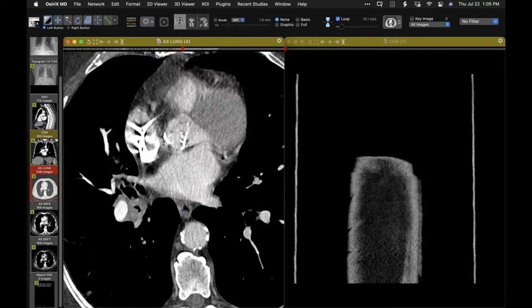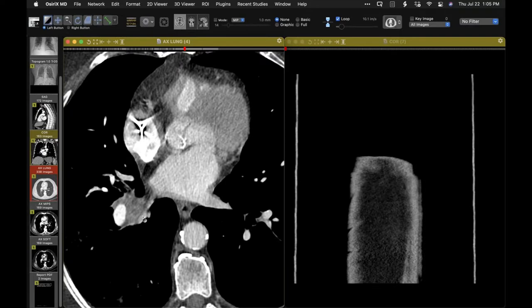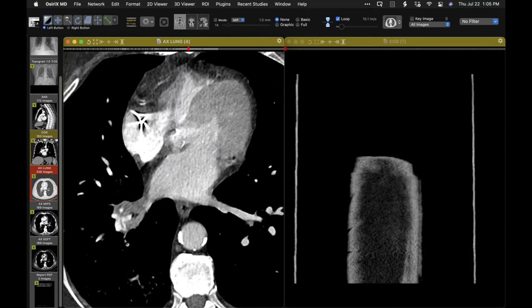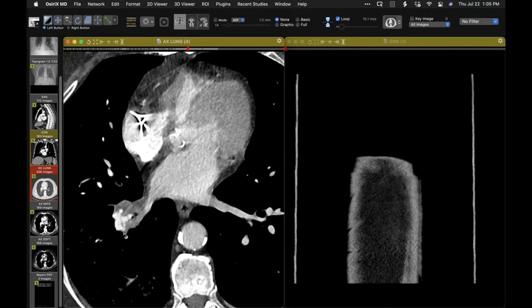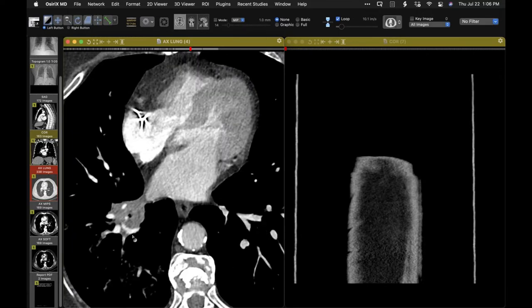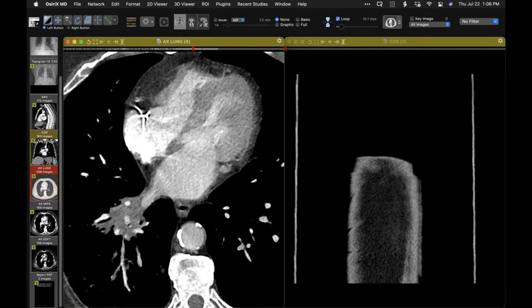But in looking at the pulmonary artery, and yes, there's also pathology in the adjacent airway, at this level here, we begin to see there is a mural abnormality involving the medial wall of that artery. And furthermore, one can also trace the passage of contrast medium, contrast opacified blood from the defect in the pulmonary artery directly into the airway right there. And then more distally, one can see the contrast opacified blood moving distally in those airways, which are abnormal.